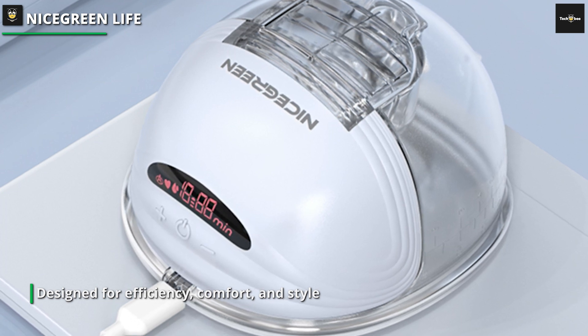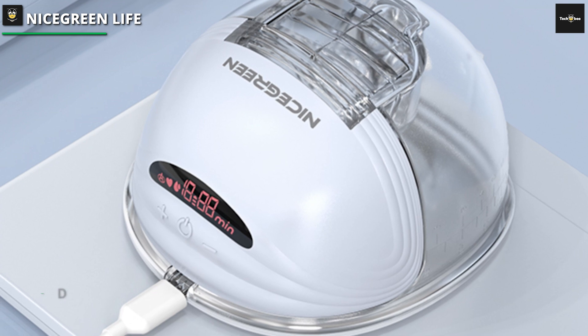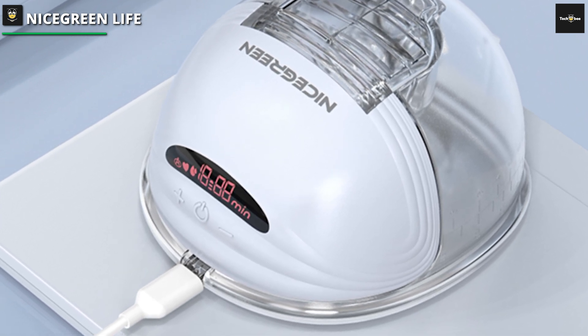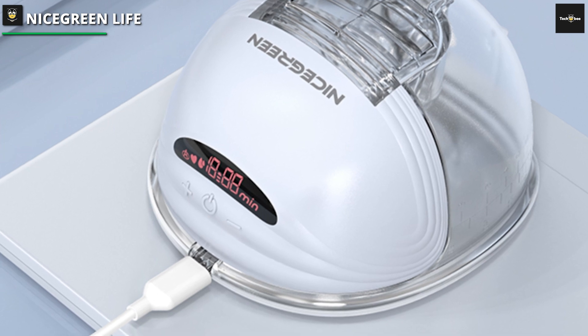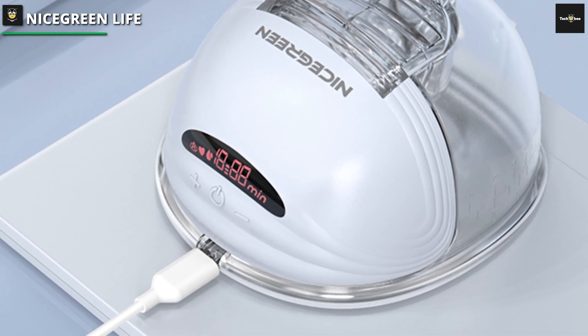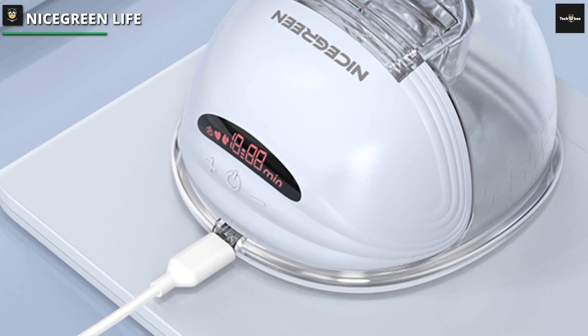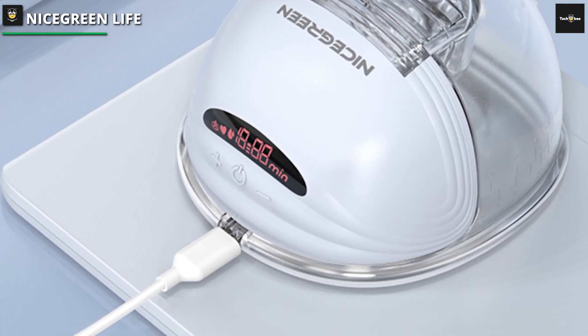Equipped with a large battery, the Nice Green Life Hands-Free Breast Pump provides extended usage on a single charge. The low noise operation ensures a quiet and discreet pumping experience. Simplify your life as a breastfeeding mom with this reliable and innovative hands-free breast pump designed for efficiency, comfort, and style.